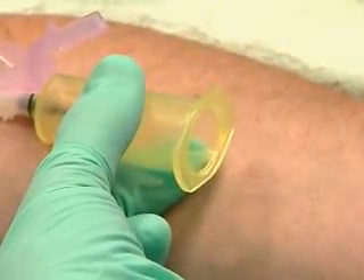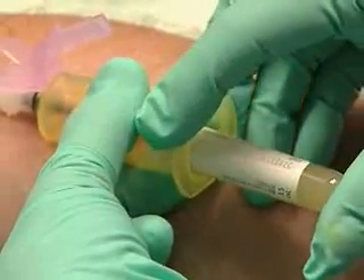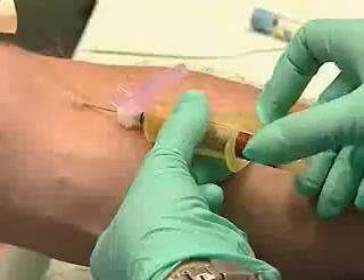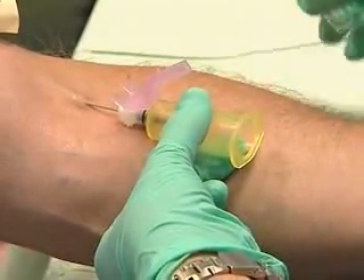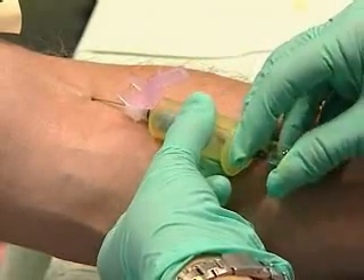In this example, we're drawing a couple of tubes for the lab. Gently oscillate the tube to mix the blood with the heparin or stabilizing agent in the tube. To switch tubes without causing the patient discomfort, you want to steady your hand against the arm. Then you can pop in the next tube without pushing the needle any deeper.